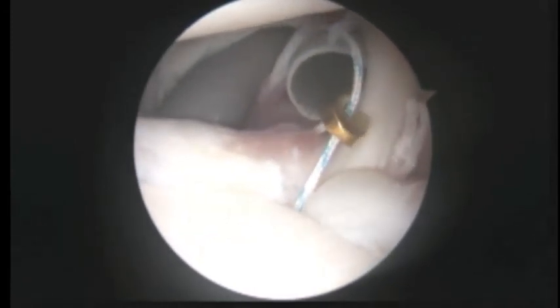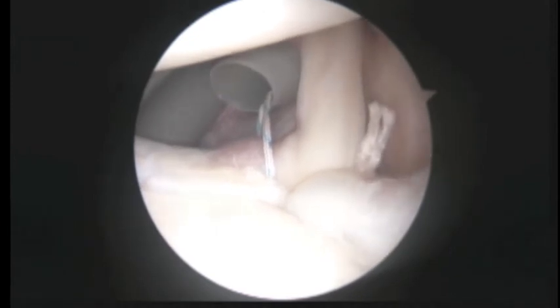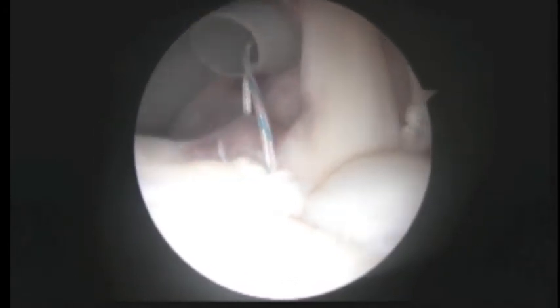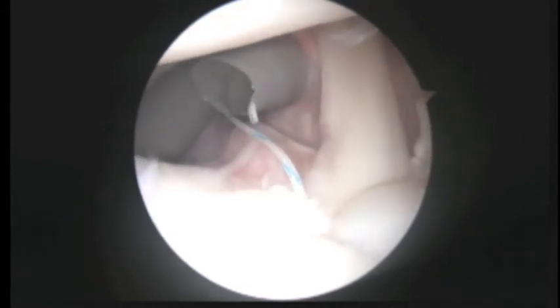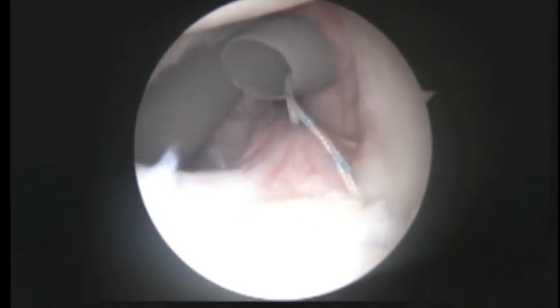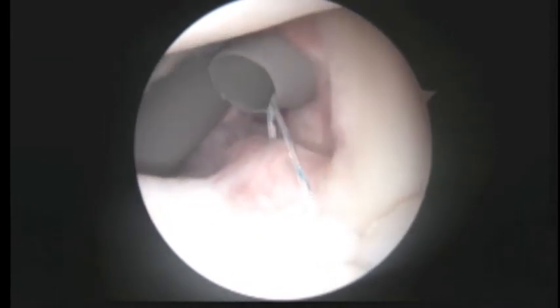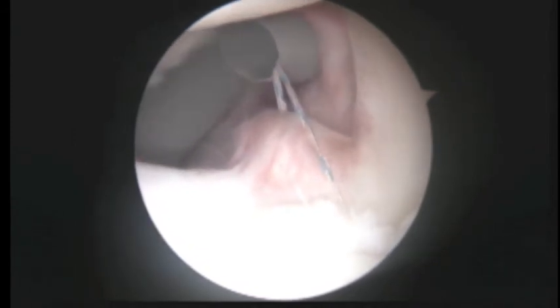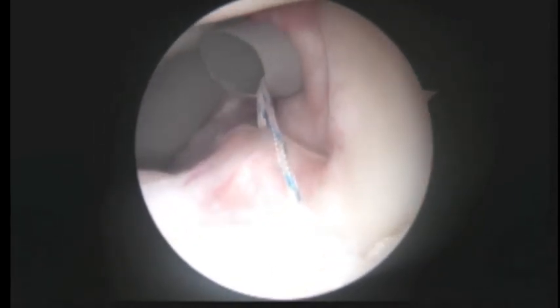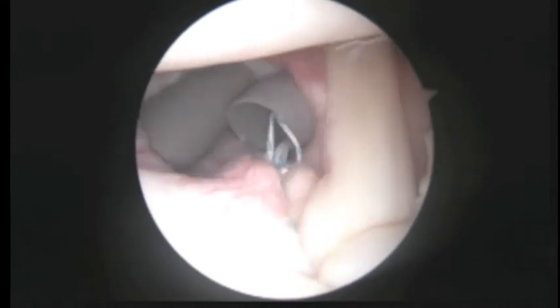So after we tie this knot, we ought to be finished. We've placed a total of five suture anchors around the socket just to tighten things up for you. Hopefully this will do the trick. Okay, Kelly, so we'll show you this last knot coming down and then we'll finish up here. There it is right there.